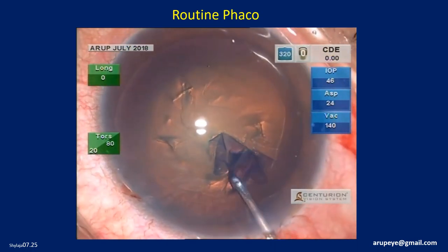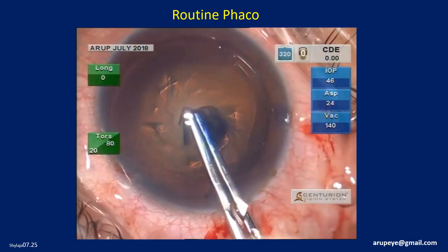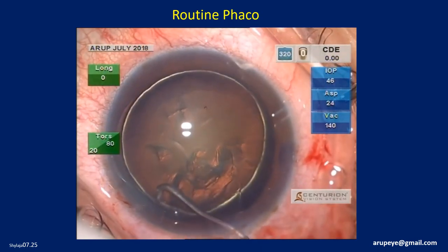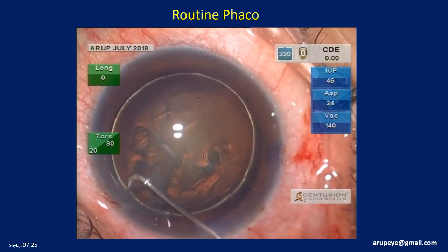The rhexis is completed from outside to inside and the capsular flap is removed, ensuring that there is no pedicle or bridge connecting the capsular flap to the rest of the anterior capsule.